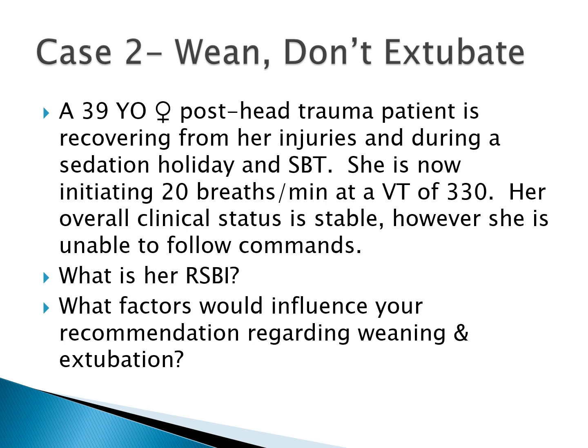Dividing 20 by 0.33 is very similar to multiplying it times 3. So her RSBI is around 60. That's a decent number. What factors would influence your recommendation regarding weaning and extubation?